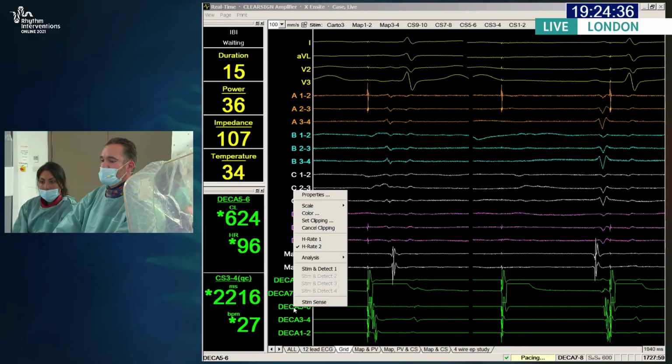Although, again, if we take a look at the data, it's not really all that convincing. But once we're there and really thinking about redoing, again, transseptal, again, left-sided ablation, the add-on risk to the procedure is actually quite low. So that's why I tend to do it. But I agree, for a first procedure there's really no data supporting it, so I wouldn't do it then, but for a second procedure you have a lower threshold to do a lot of additional things.